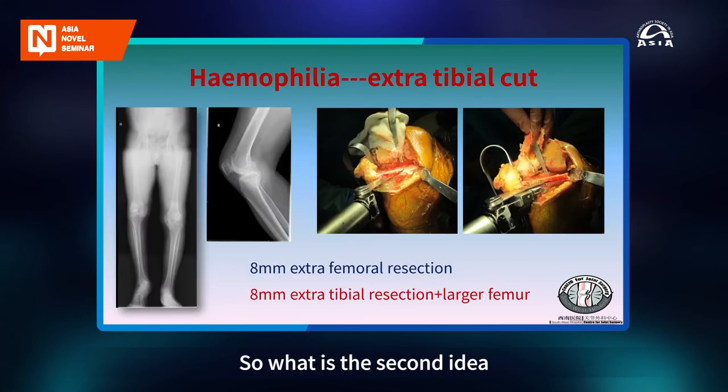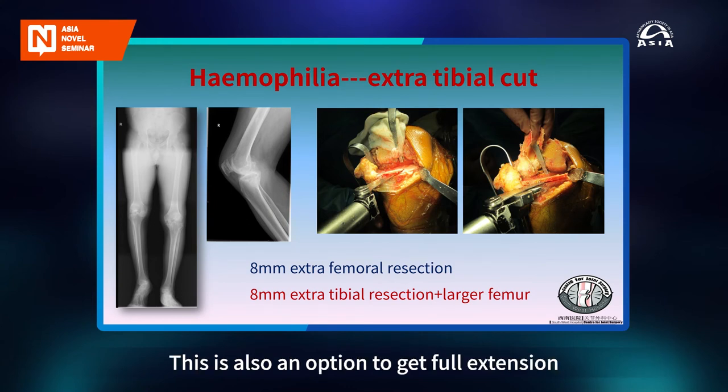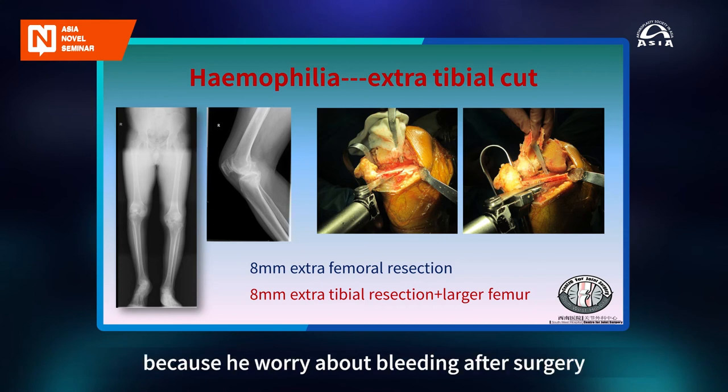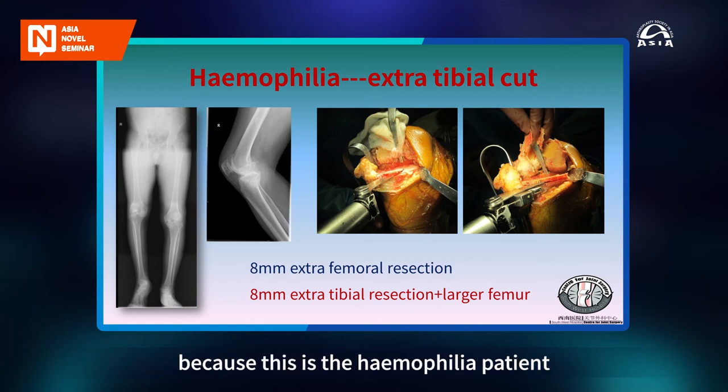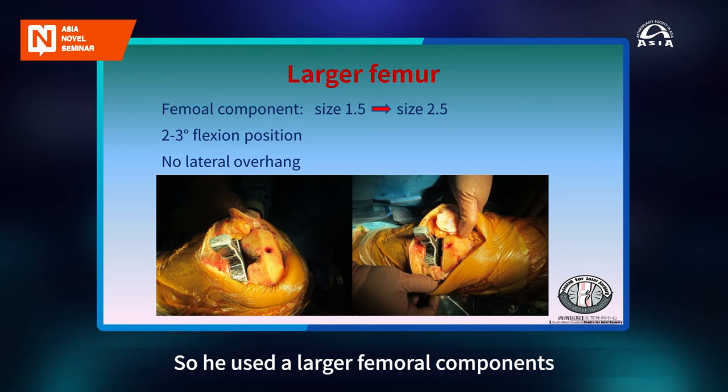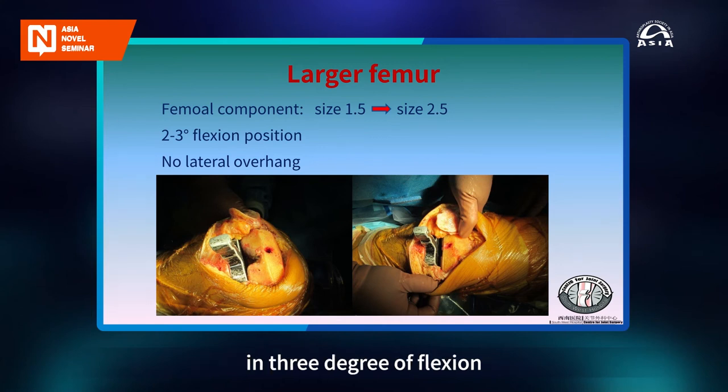So what is the second idea, removing extra tibial bone? This is also an option to get full extension. Like in this case of hemophilia, the surgeon did not want to release too much soft tissue because he worried about bleeding after surgery, as this is a hemophilia patient. So after removing 8 extra millimeters from the distal femur, he removed an extra 8 millimeters from the tibia to get full extension. But he had a problem with the flexion gap, so he used a larger femur component from size 1.5 to size 2.5. And he put the femur component in 3 degrees of flexion, and there's no lateral overhang.